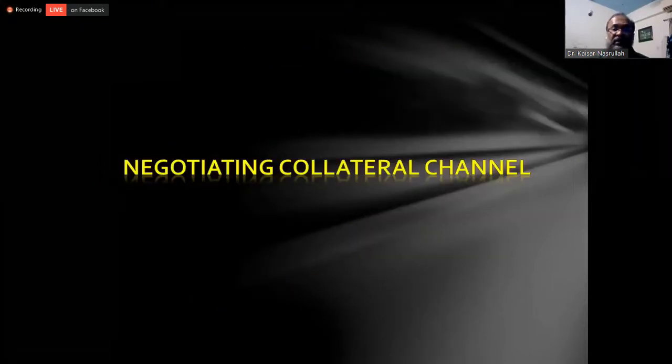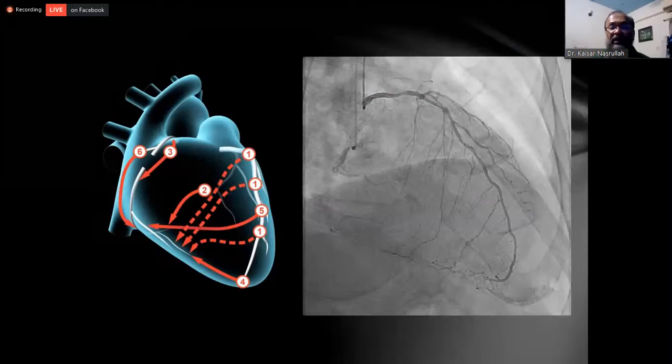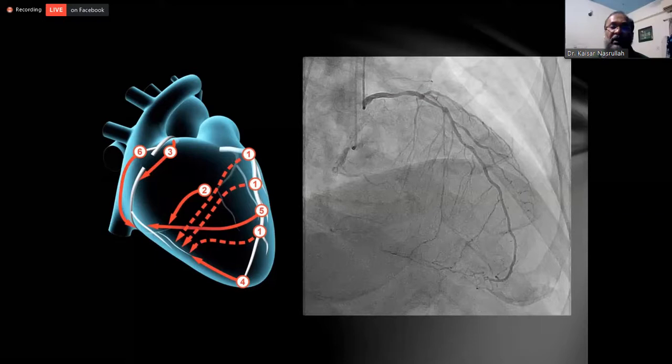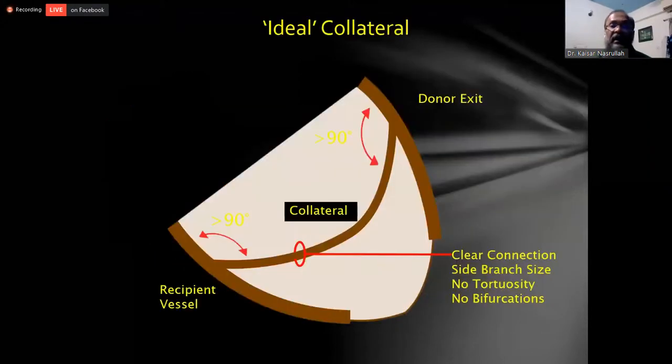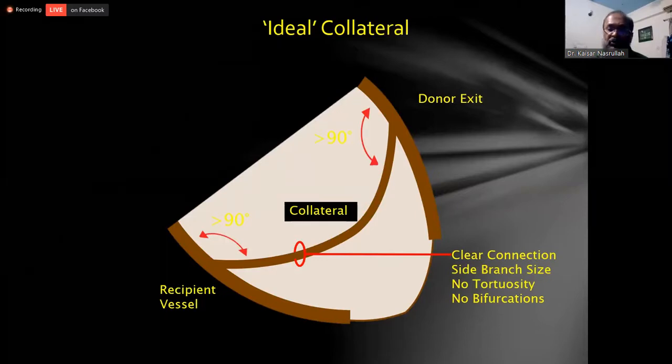Now, next is negotiating collateral channels. There are four types of collateral channel: septal, epicardial, venous graft, and LIMA. Before doing the retrograde, you have to take a picture properly and select which collaterals you will go through one by one. And before choosing the ideal collateral, you have to see the angle between the collateral and the donor and recipient vessels, and there should be no tortuosity, no bifurcation, and a clear connection.